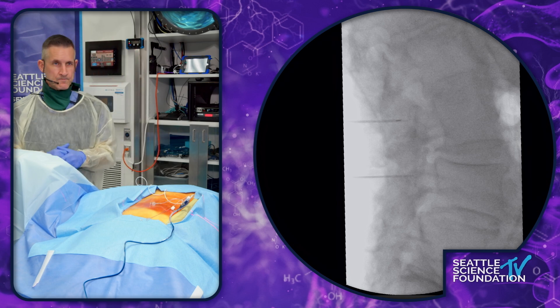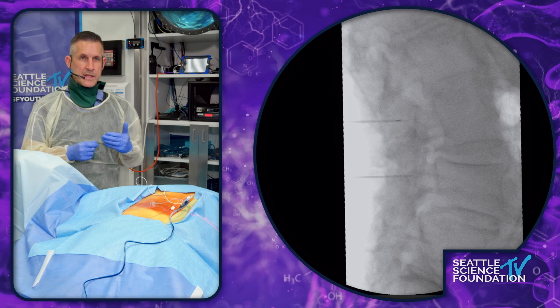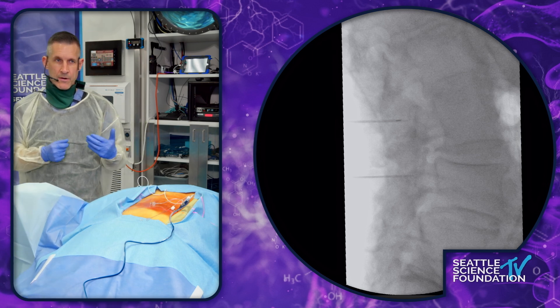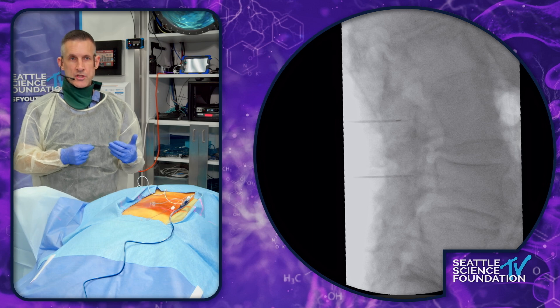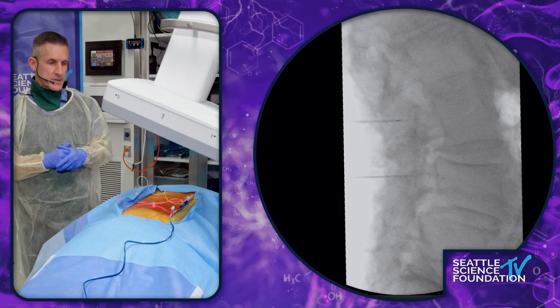Then I go to a straight AP picture. Three images to see that I'm in the right place and that I'm not going to harm my patient. We always set out to make our patients better, and just by taking a few precautions — using the right tools and knowing the tools you're using — it decreases the risk substantially.